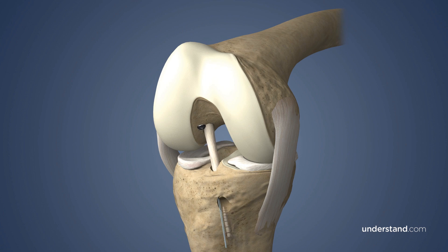The surgeon may twist the graft before tibial fixation to mimic the rotational fibers of the native ACL. Over time, the bone plugs from the graft will incorporate into the surrounding bone.